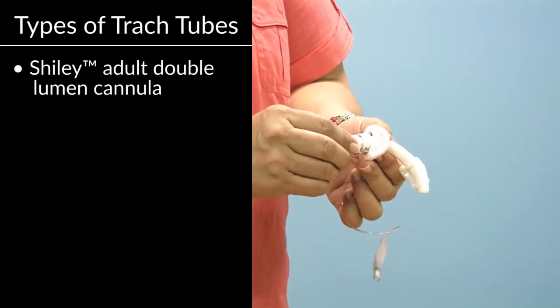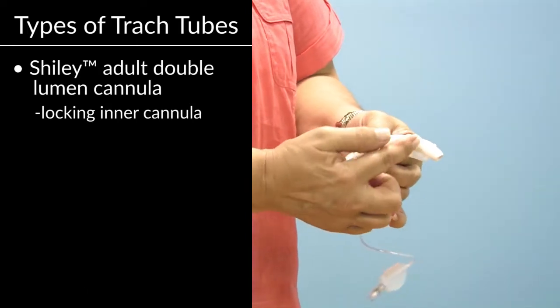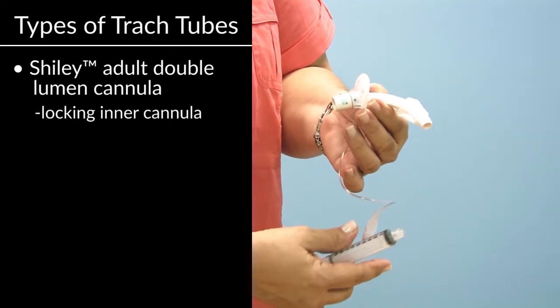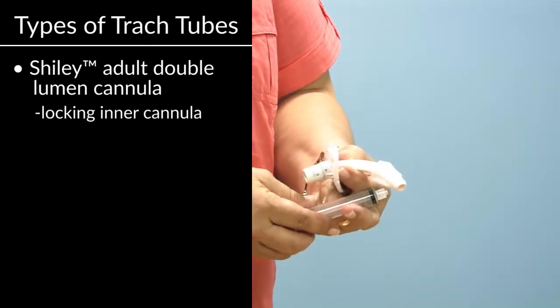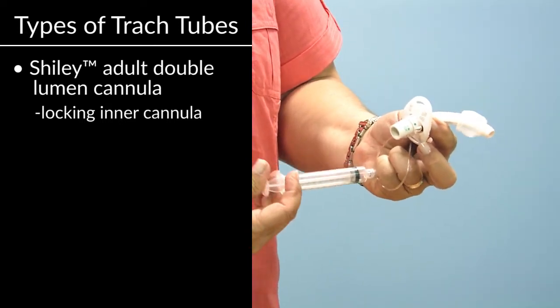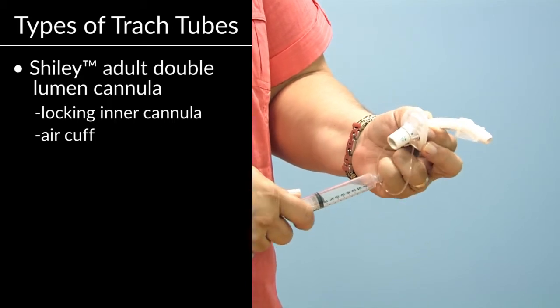So after the tube is placed into the patient, there's a locking inner cannula. You can see the tracheostomy cuff on this tube. This is deflated. And I'll show you why that's a little bit different in the other type of tube we have here today. So I inflate the cuff, it's an air cuff, and I deflate it.